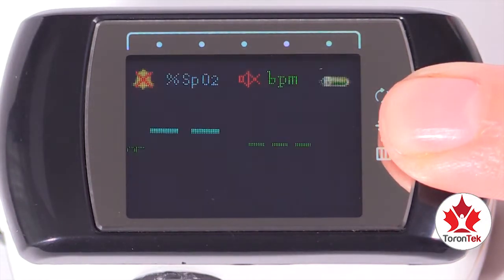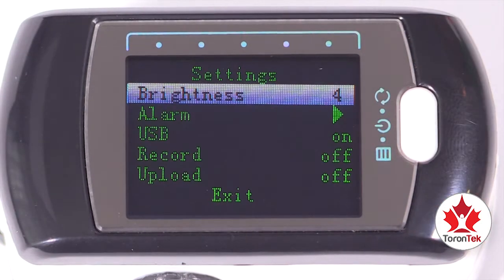To enter the main menu screen, press the menu button for two seconds. The menu screen will display the settings available.